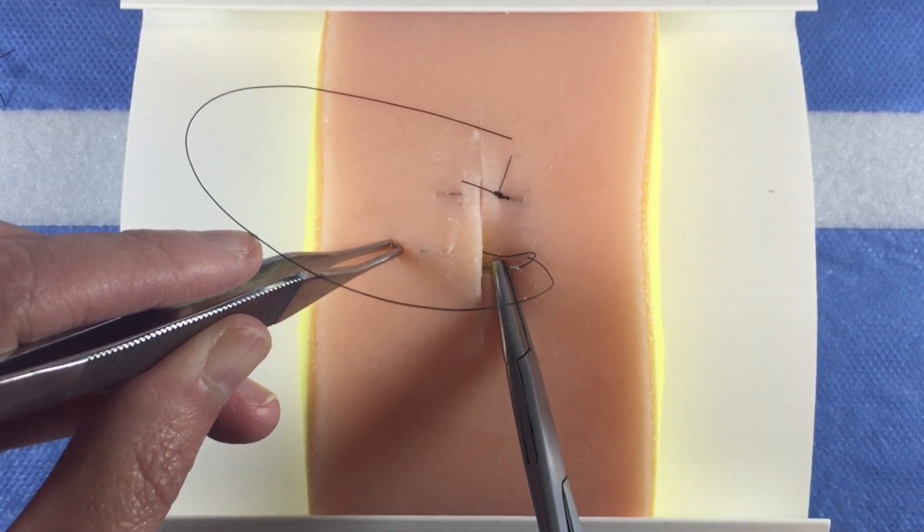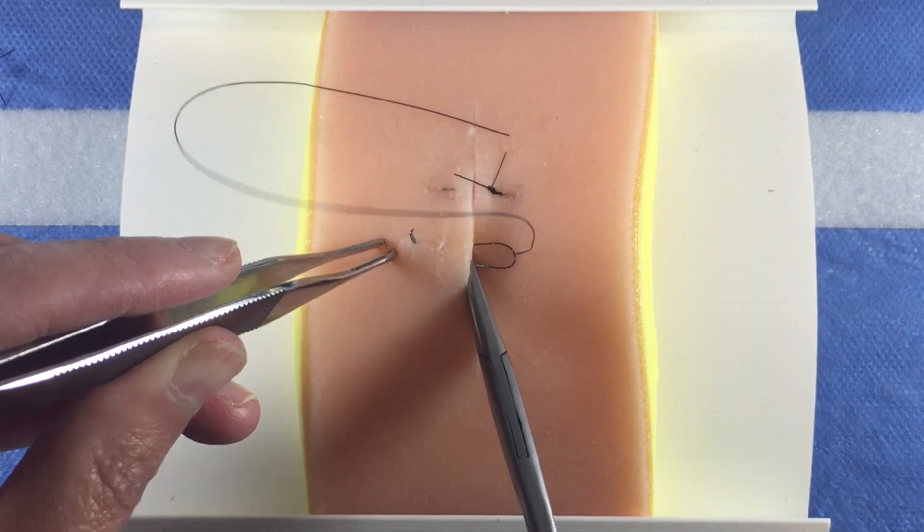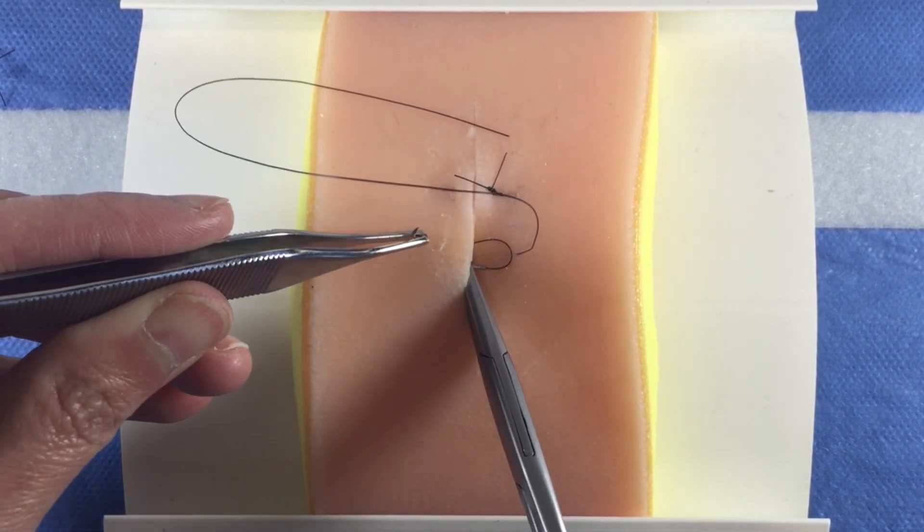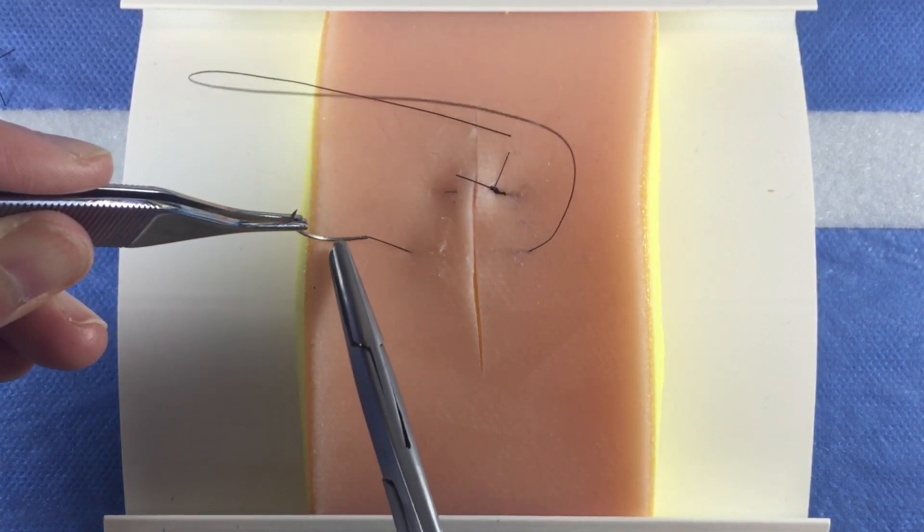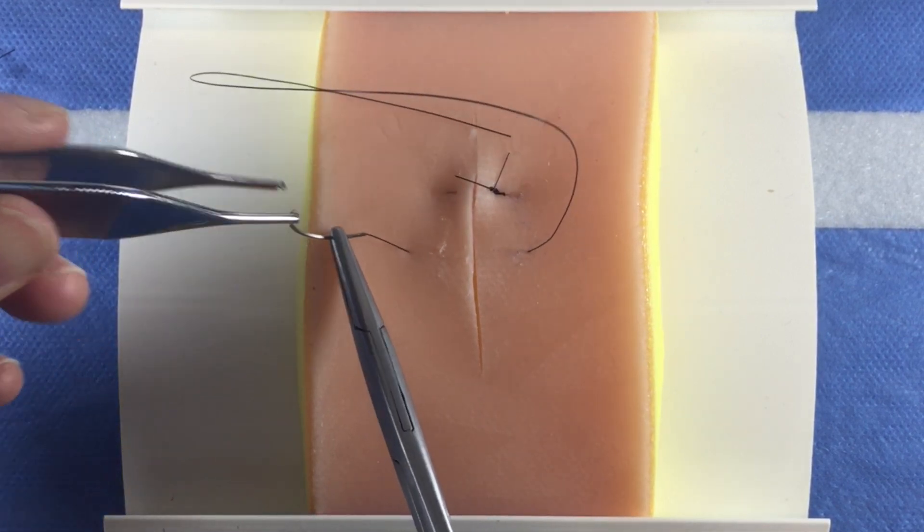Be sure that the needle is coming out and going in at the same depth so the skin edges will come together evenly. Exit the skin at a distance symmetric to where you entered.